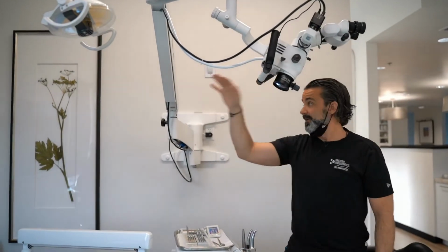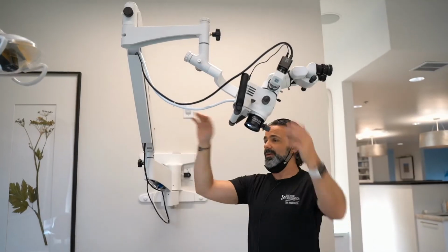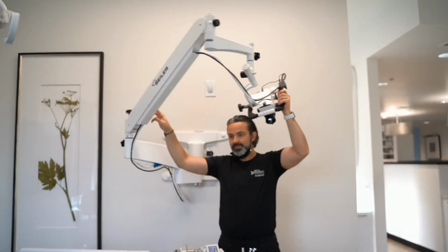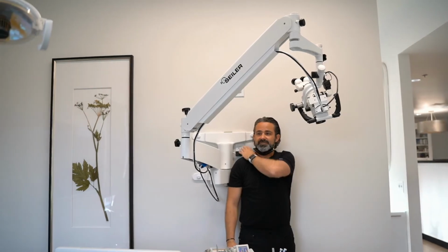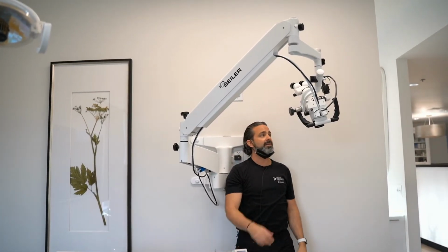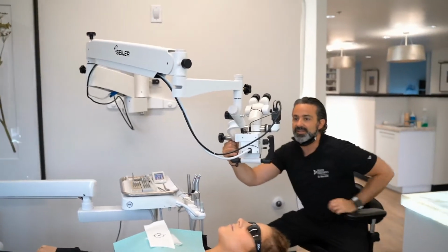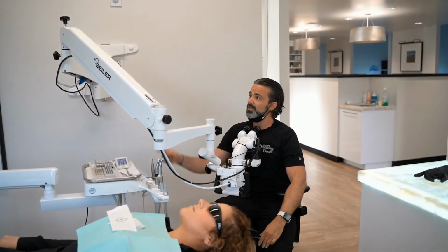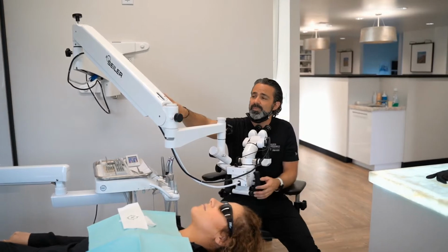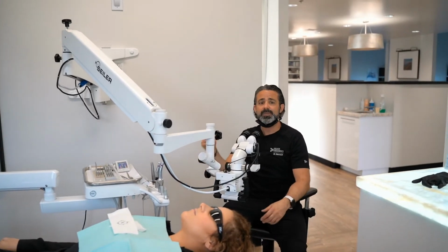So we're not bumping heads, or if the patient wants to jump up out of the chair and take a potty break, this longer boom, whether I'm standing or sitting, is really advantageous. I can turn it so, let's see, I'm looking at your image here. I'm 5'9", and I'm mounting this just at ear level, I guess. And when I go like this, I have no problem standing around it, and I have no problem at that same height sitting and bringing it down. In fact, I could even come down and move the microscope right below my chin. So this arm-length boom is something that I really like as far as working around patients in the room.